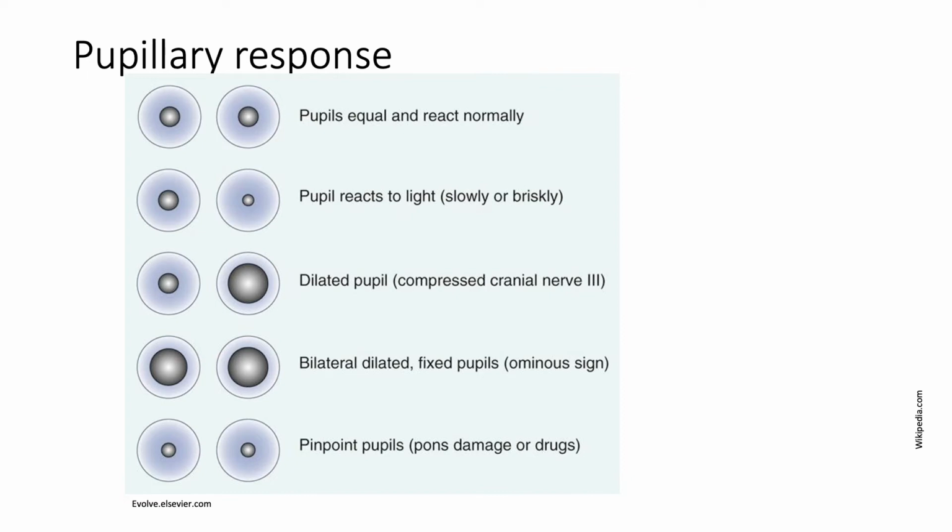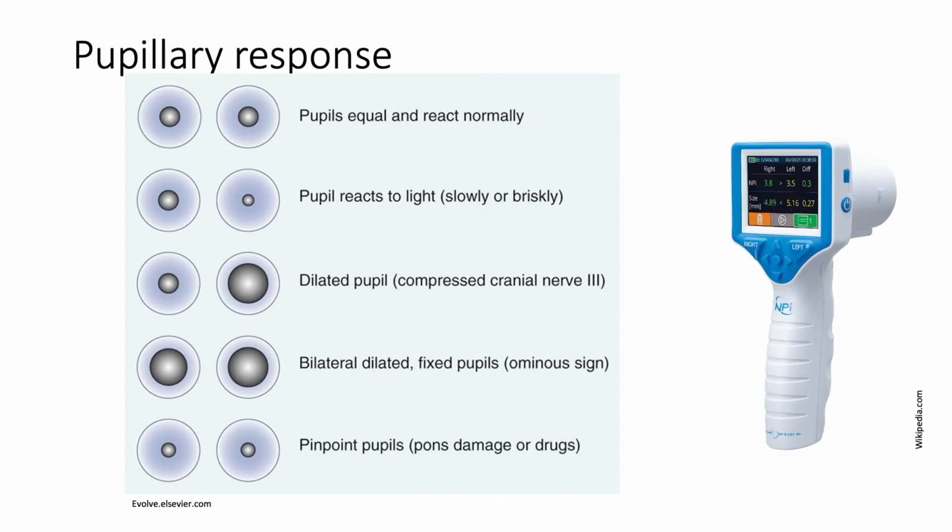I'm not sure. Or are those 3 millimeter or 4 millimeter pupils? Pupillary assessment can be really subjective and leave a lot of room for human error. So research is showing more and more that an objective pupillary assessment, especially in these high-risk settings, can be invaluable to patient care. This is where pupillometry comes in.